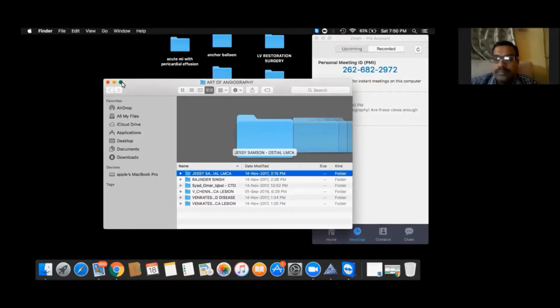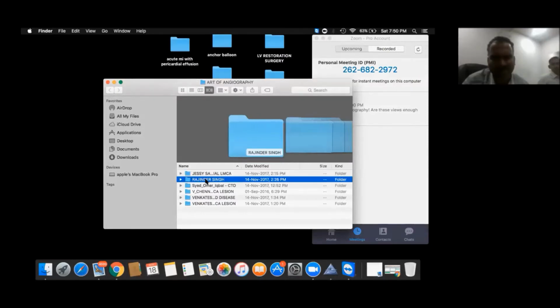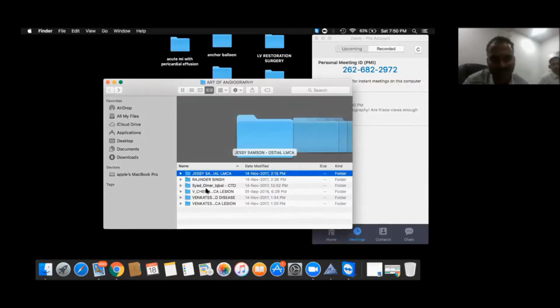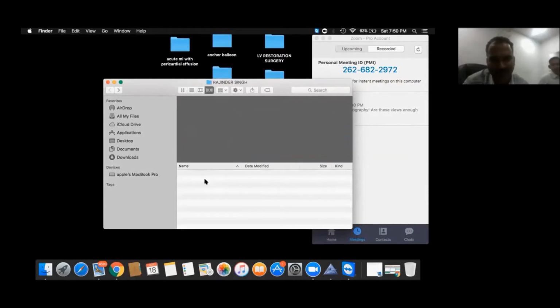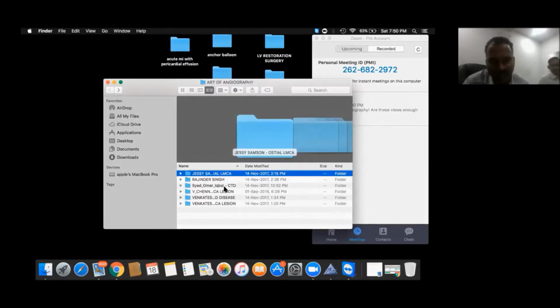Sridhar, are you able to see? Yes, I am able to. Yeah, right. See, I'll just show. Forgot. So where is the angio? Oh, I think I missed this one.